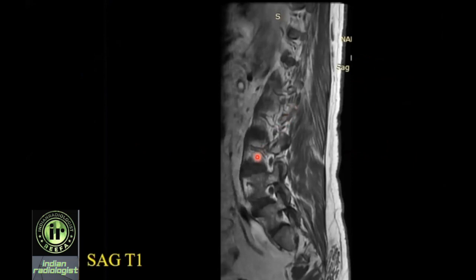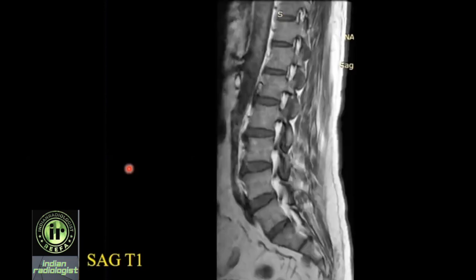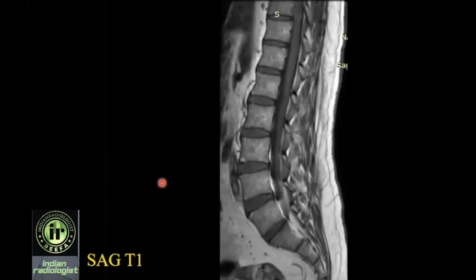We will review the sagittal T1-weighted images again to understand the anatomy. We have obtained 4 mm slice thickness cuts from left to right. You can see the pedicles of L4 and L5, the neural foramina, and the exiting nerve roots — L4 and L5. The superior articular facet of L4, inferior articular facet of L4, and the facet joint are visible. Coming further medially, you can see the pars very well, the neural foramina, and the keyhole-like appearance. Again, inferior articular facet of L3 and superior articular facet of L4. Coming further medially at the level of the lateral recess, we are seeing fat in the lateral recess — because this patient's canal is nice and wide, you can see fat in the lateral recess very well.